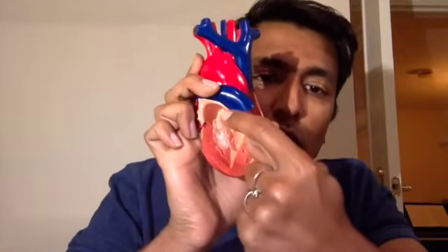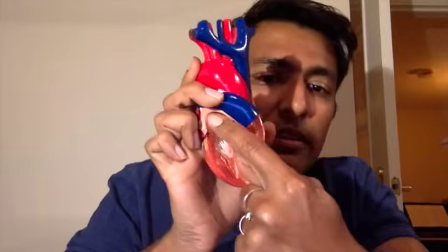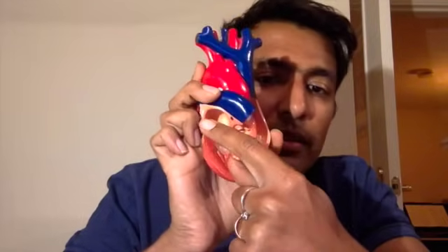What is normal-sized? Around about 4 centimeters across. So the echo report will have some measurement. Some places they measure the volume, but other places they just measure a dimension. And if the dimension is less than 4 centimeters, then that tells you that the left atrium is not enlarged. What does it mean if the left atrium is enlarged? Usually it means that the heart is having to work harder than it needs to.